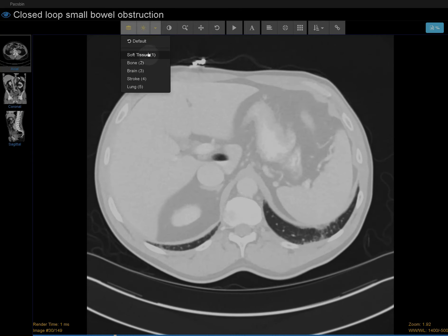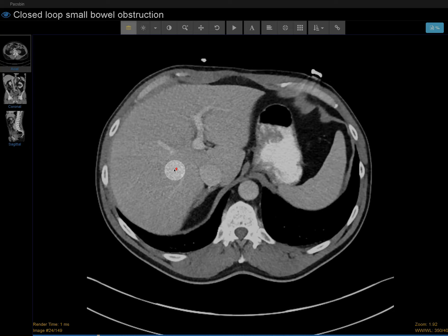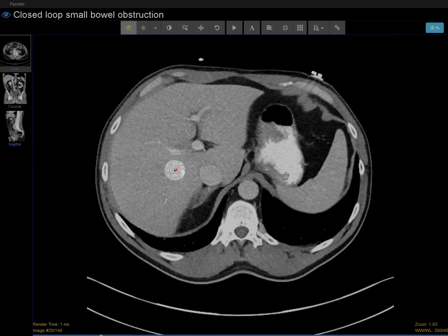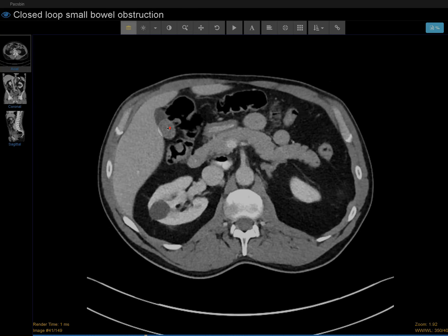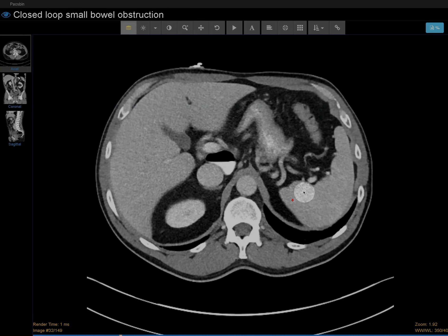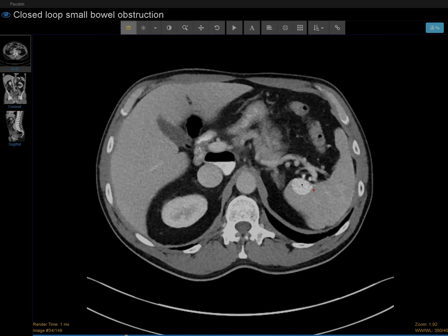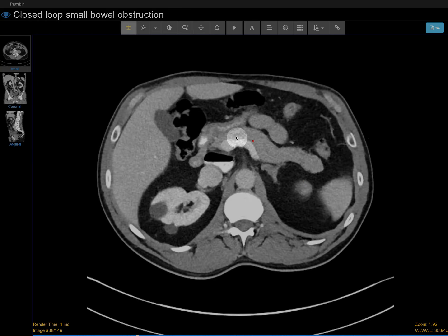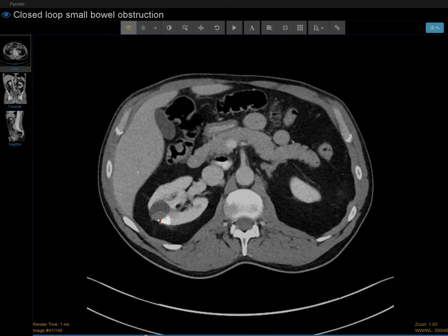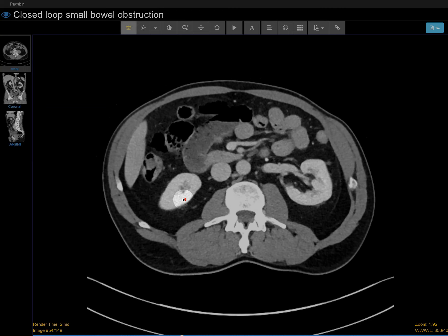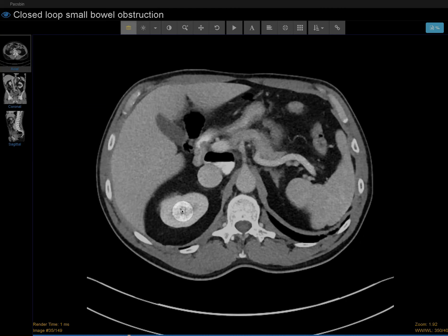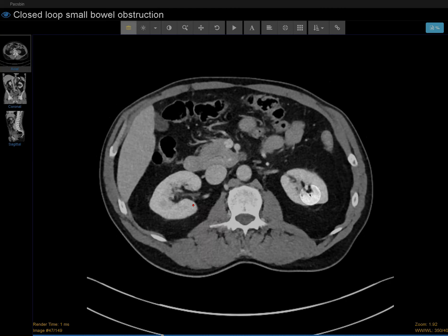Let's go down to the abdomen and pelvis. The liver looks okay, gallbladder looks okay, spleen, pancreas. There's a bunch of right renal cysts. I didn't see hydronephrosis or a large stone.